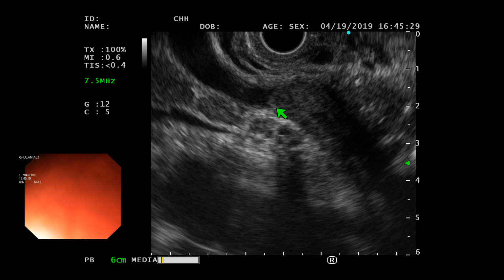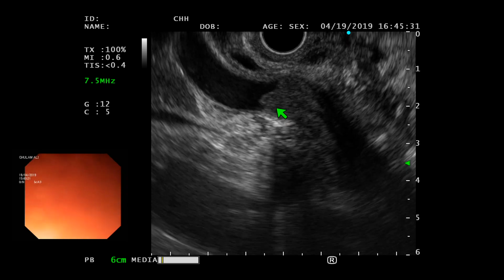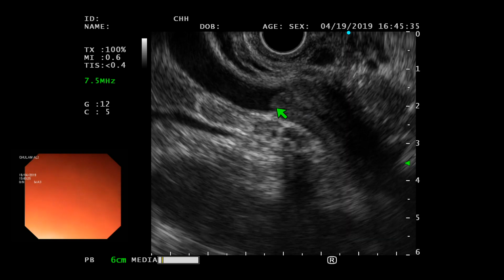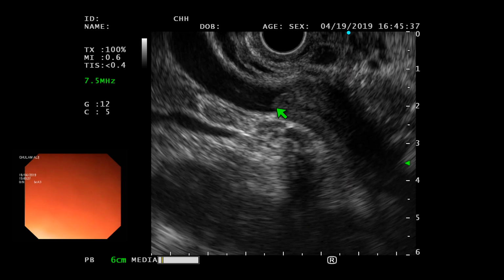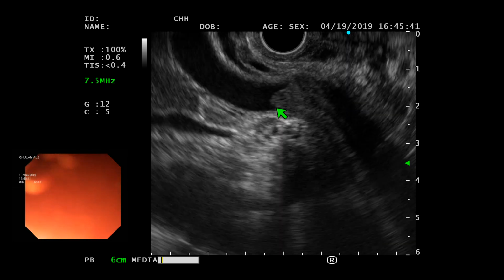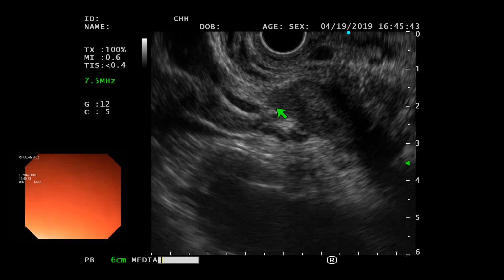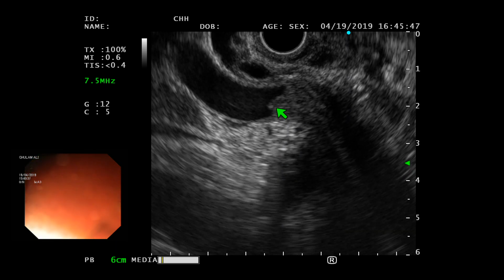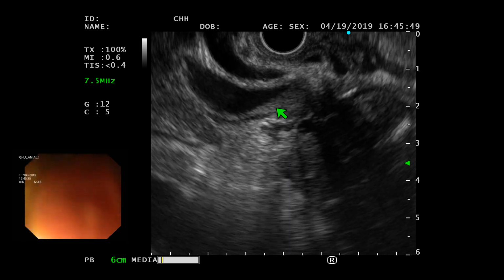Unfortunately, I think it's a cancer in there. There is a lot of necrosis. So possibly that's the reason that we have portal vein thrombosis as well. Yeah, and portal vein thrombosis can happen with that bad of pancreatitis as well. But yes, I think it's a cancer with the setting of a chronic pancreatitis.